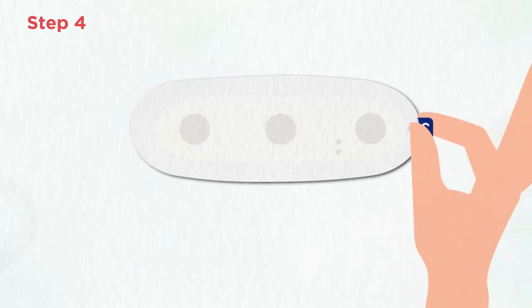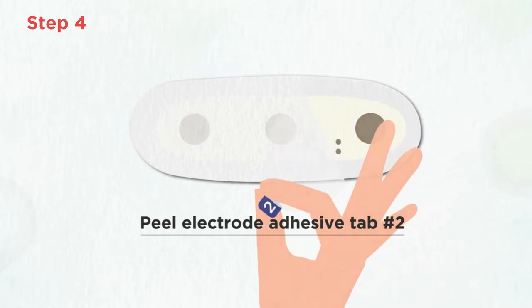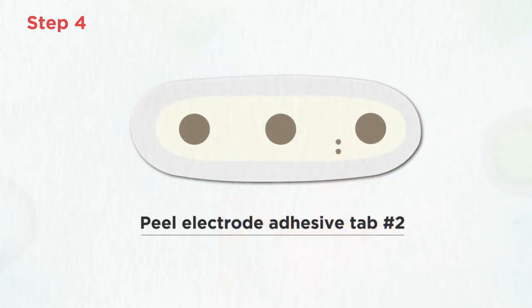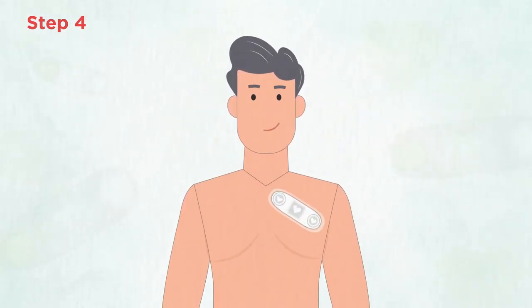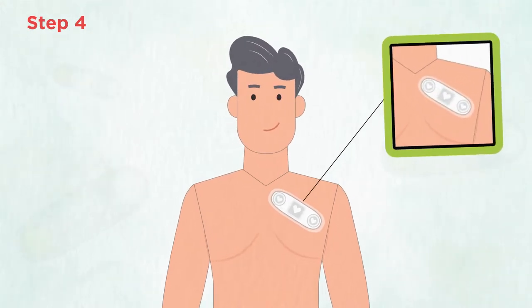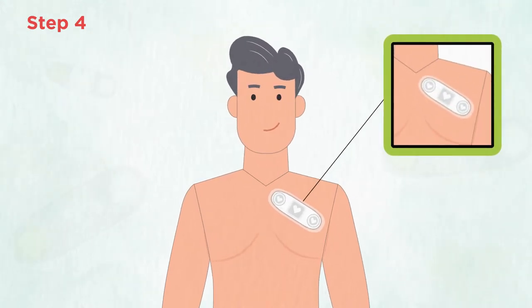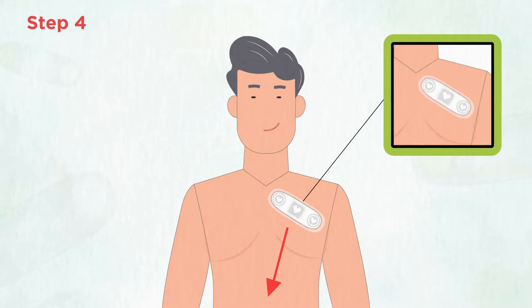Remove the tab on the adhesive labeled number two and hold the device flat, left to right. Place the sensor on your left pec, close to the sternum or breast bone. Tilt down the left side of the adhesive so the three hearts point to your right foot and adhere the sensor to the skin like you would a band-aid.